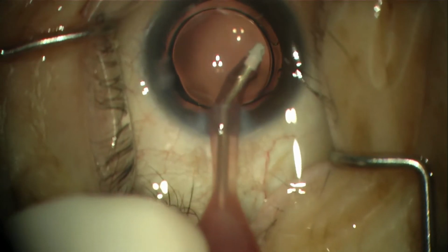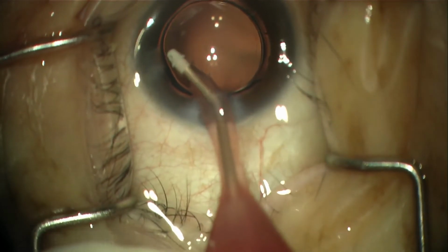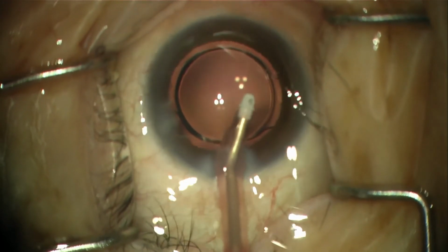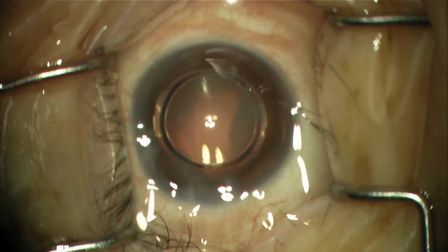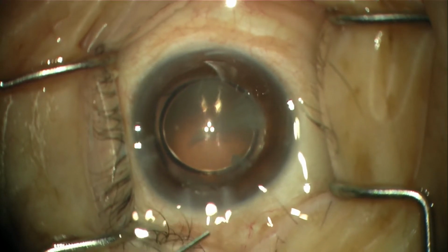And we're also trying to remove any retained small microscopic pieces and ensuring that the lens centration as well as placement looks good. You can see how well centered it is. We have some of the antibiotic and steroid seem to be coming back.